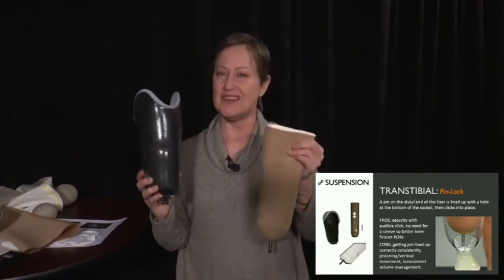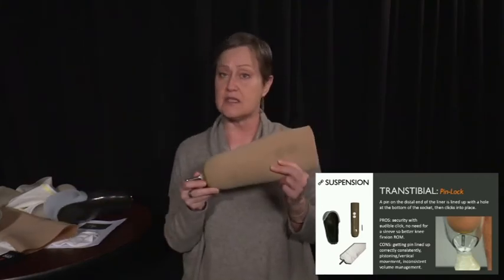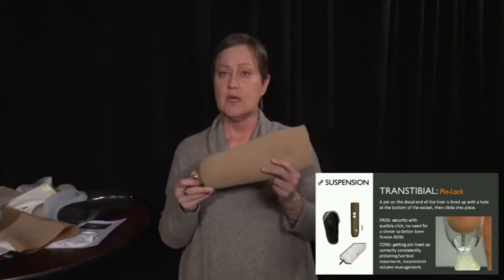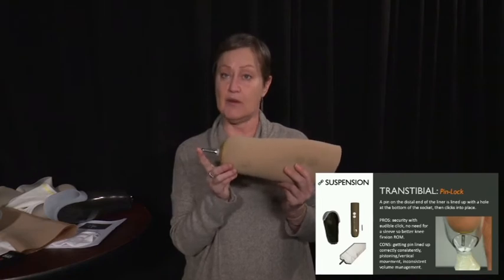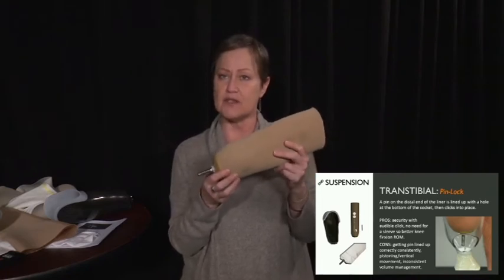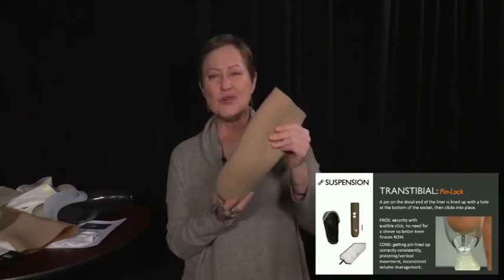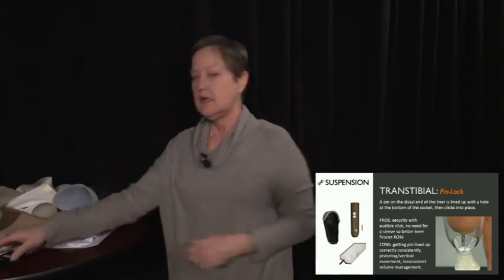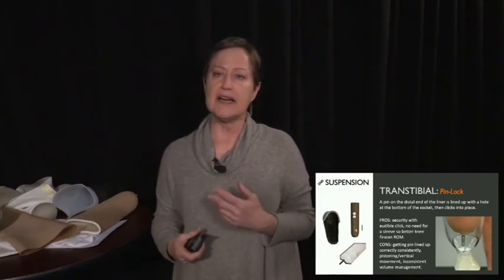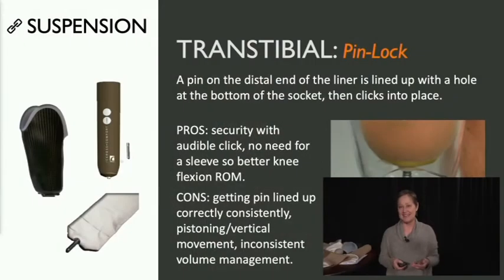Also, you don't get the best volume management. So you do use socks with this system just like you do with the other systems, but you might find that there's still more pressure at the very end where the pin is, at the distal end of their residual limb, if they're not managing their socks correctly. And you can also get a little pistoning in there, in the pin lock. So you may or may not see that. We don't do that many of them anymore, but they are the right thing for the right patient. And that's, again, a great conversation with the prosthetist.